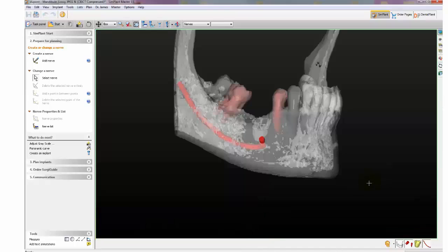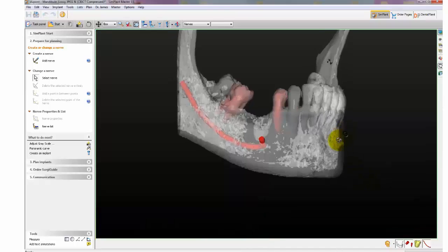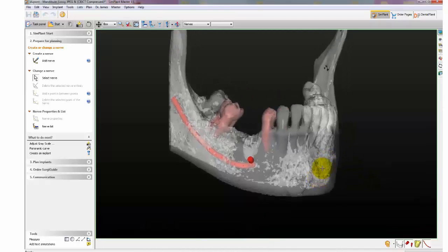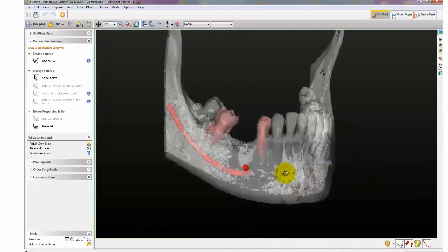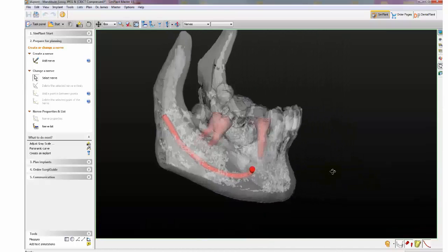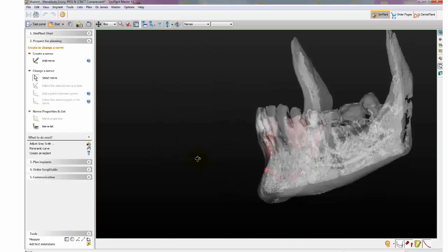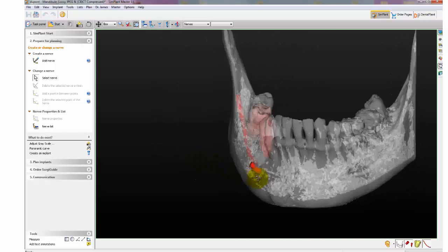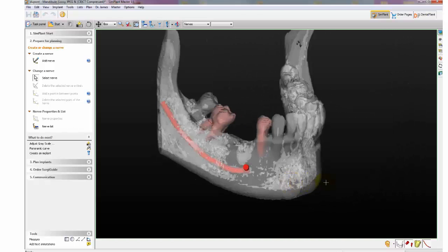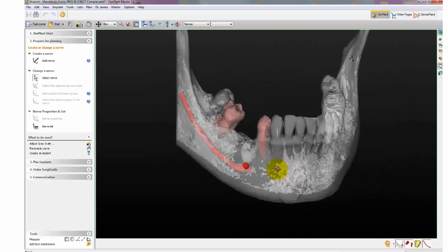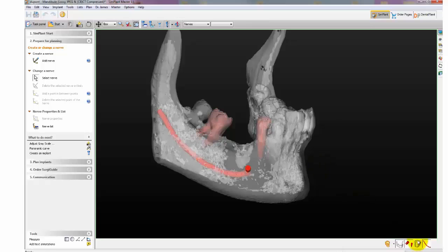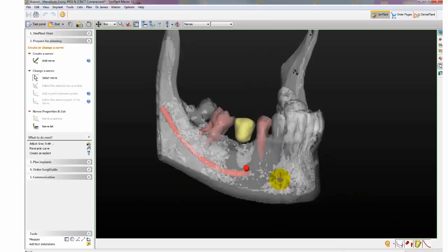You can also see the nerve within the 3D view by clicking on the Transparency tool. Here is the virtual tooth within the 3D view.